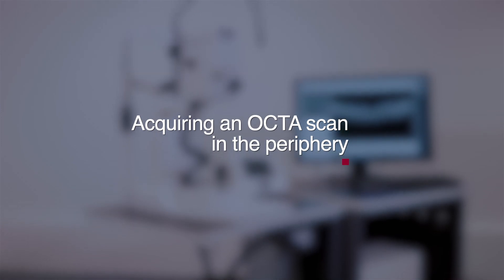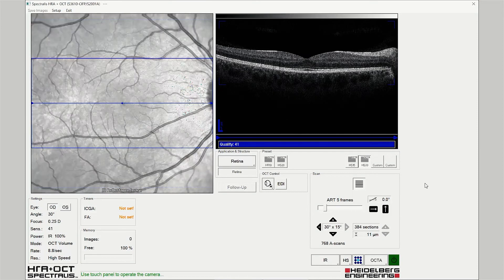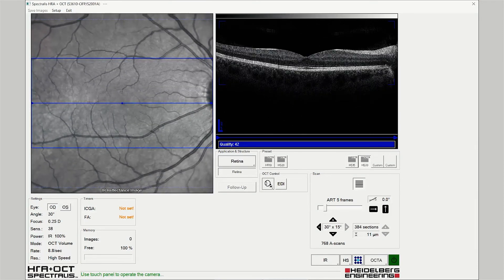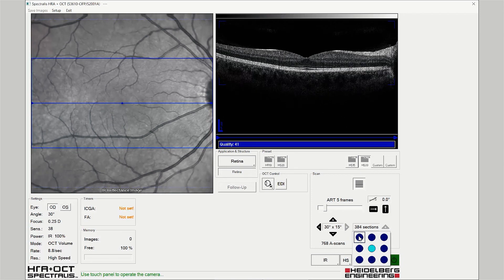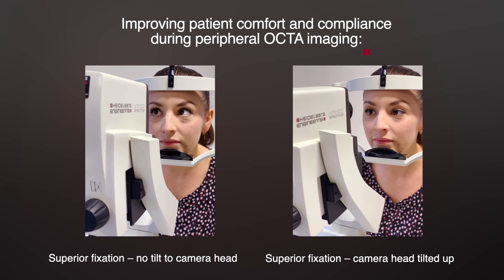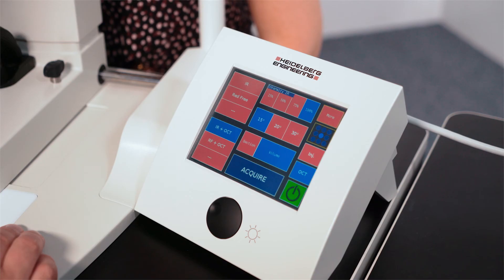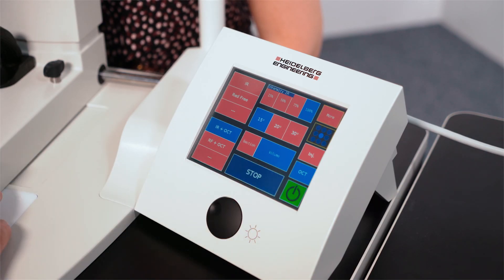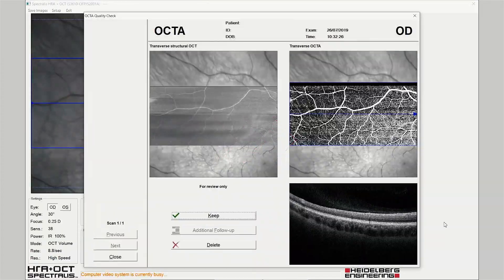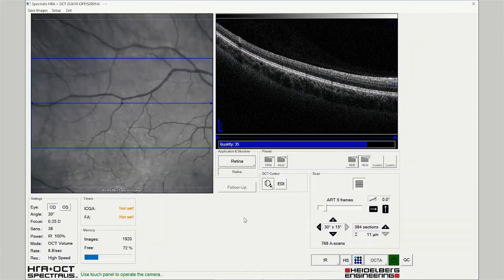Acquiring an OCTA angiography scan in the periphery. Acquiring OCTA images in the retinal periphery can be fatiguing for the patient if they have to adopt an upward gaze. Therefore, the camera head should be adjusted to provide a central fixation target, improving patient comfort and compliance. The scan is then acquired, reviewed for quality control, and saved.